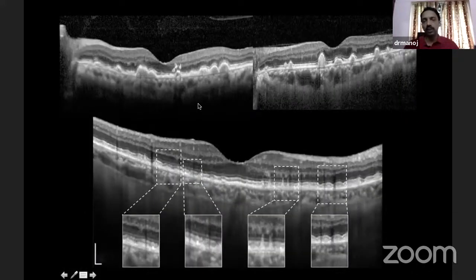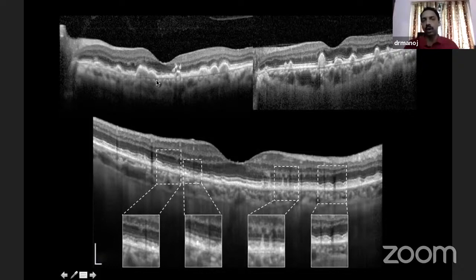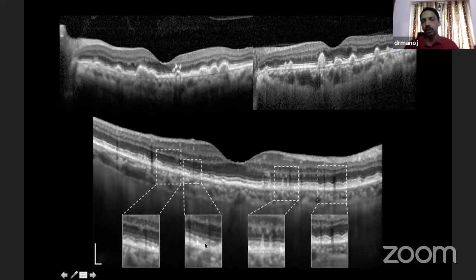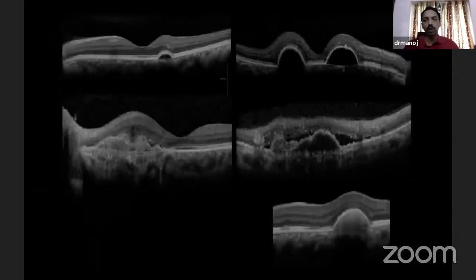There are certain diseases where the outer retina seems to be affected. These are examples of drusen — the pathology is lying under the retinal pigment epithelium, the RPE is pushed, and therefore the overlying layers are also pushed. This is a confluent drusen. These are examples of retinal pseudodrusen, where this enlarged picture clearly shows that the deposits are lying between the retinal pigment epithelium and the ellipsoid zone — also called subretinal drusenoid deposits.